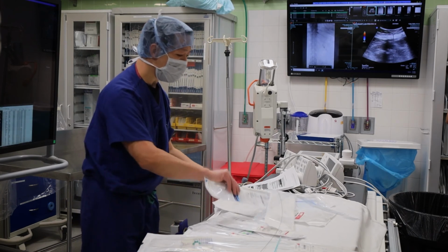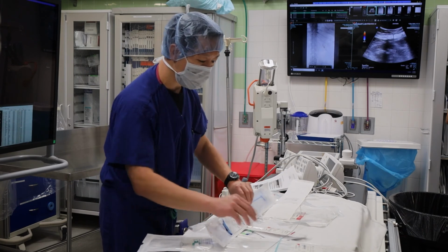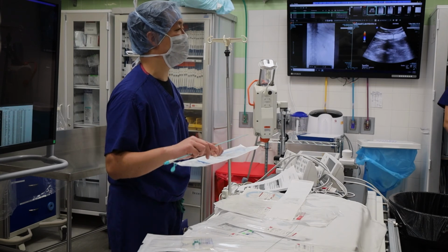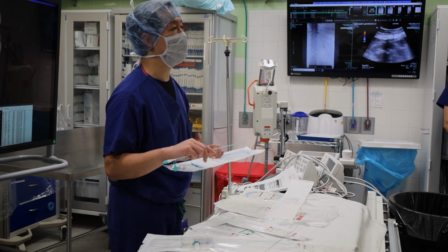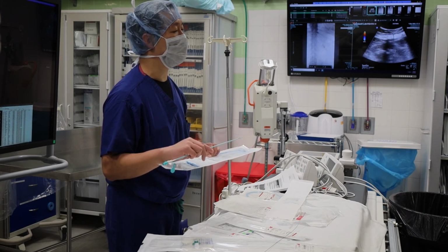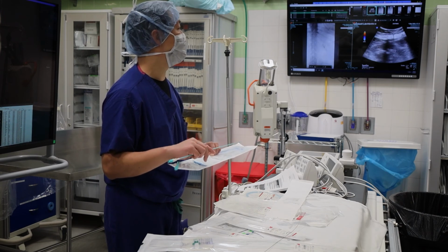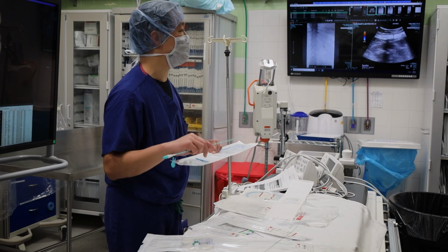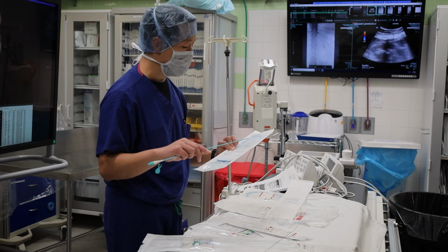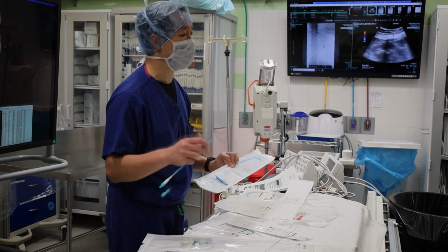Another thing, before I forget, because I've been burned by this once. I know that our EPIC orders are kind of confusing. There is an IR nephrostomy and an IR nephroureteral order. Just be aware that whatever people order is often incorrect. So don't assume that what they ordered is actually what we're doing. We obviously look at the whole patient to figure out what we're doing beforehand. There have been times when people say we're doing a biliary, or we're doing a nephroureteral stent, but instead we're only doing a perc neph.